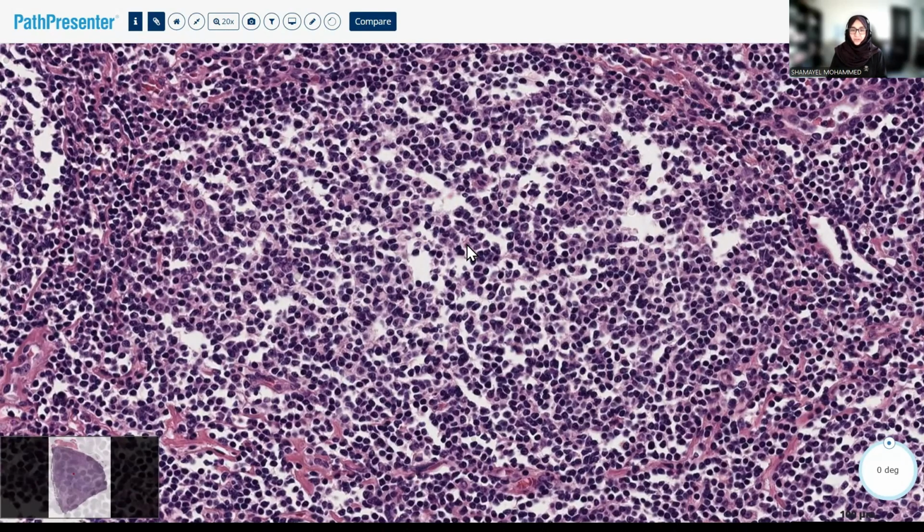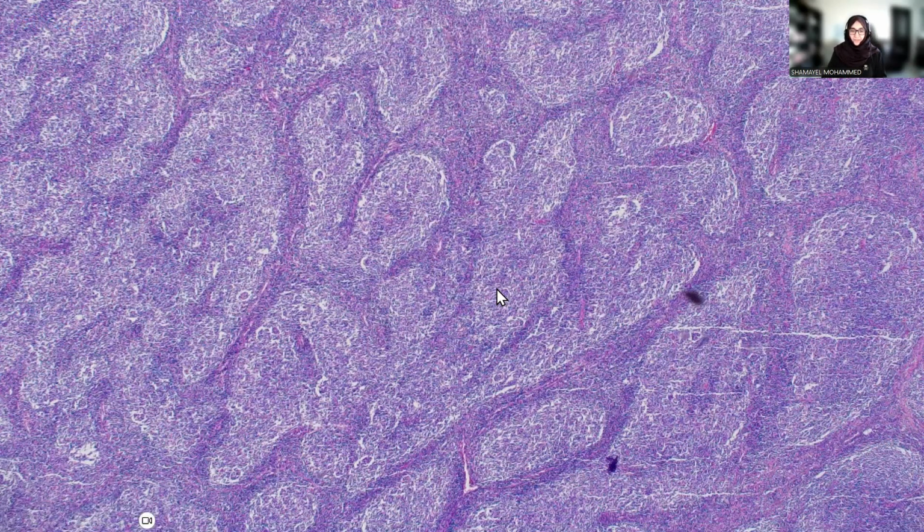So in this group, when you see this kind of morphology, we think of an umbrella of differential diagnoses, which are under the category of small B-cell lymphoma proliferation. Now, this is given that these are B cells. So let's head to the still images and show you some immunohistochemical stains.